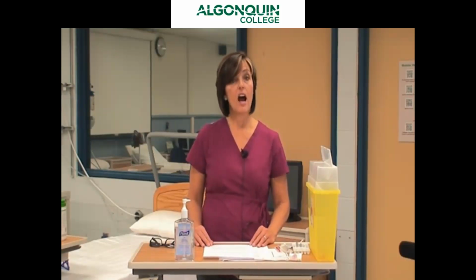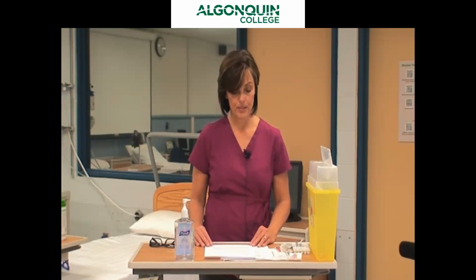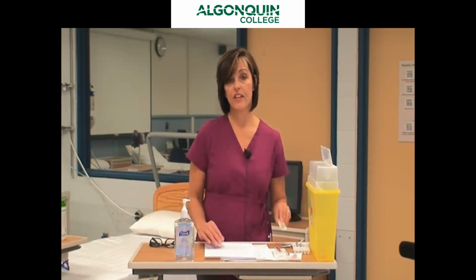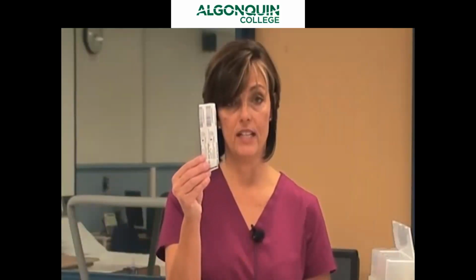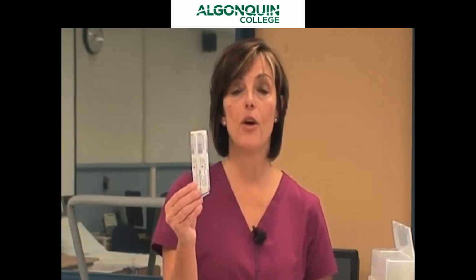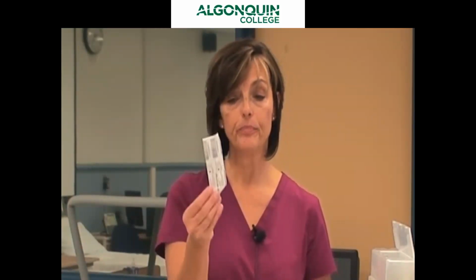Again, an IM or intramuscular injection is a sterile procedure, and we need specific equipment. We have our doctor's order and our medication record. In addition, we would need a syringe. Because we know we're only going to give a small amount of medication to Noelle, we would get a 1 ml syringe.